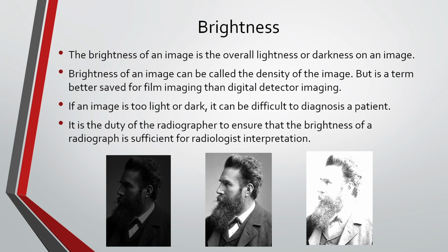We have some examples here with our buddy Mr. Rankin. This one here is obviously too dark. This would be a well-represented image. We can't see much detail in his beard or in his hair. All this is kind of flat here, where we can see some more detail in here. So this could make it difficult to diagnose.